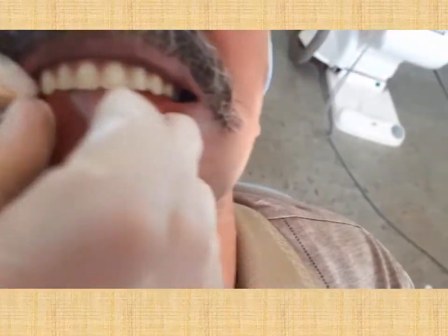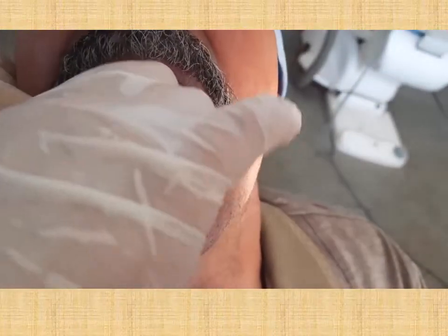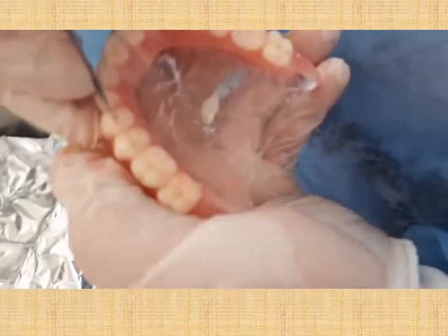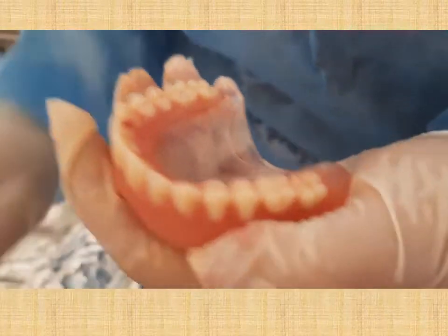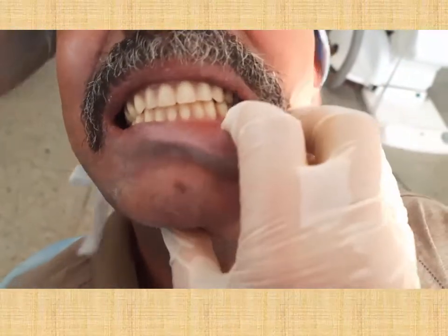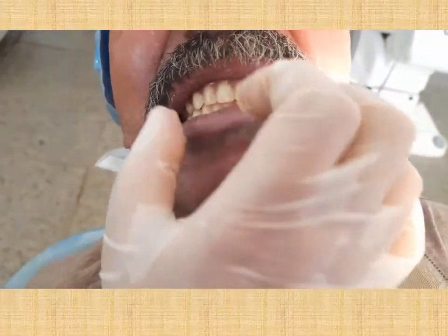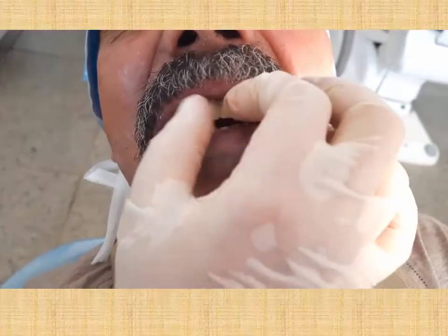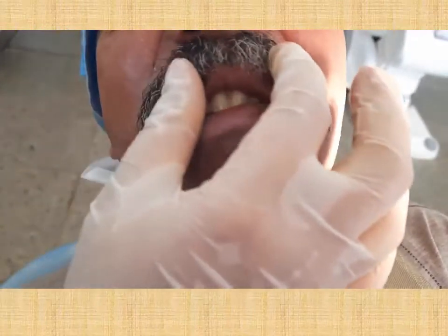Make sure the patient closes in centric position each time, not the habitual position. Recheck and again a high spot is present between the lateral and canine, and another on the center of the upper central incisor. Remove these with the low-speed handpiece. After finishing selective grinding, all teeth are in even contact. Ask the patient if one side feels heavier than the other — the patient confirms both sides feel even. Check patient approval: ask if the patient is satisfied with the shade, size of the teeth, and facial appearance. Provide a mirror so the patient can see the result.